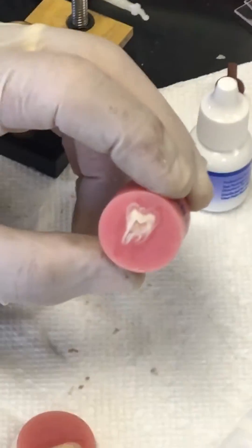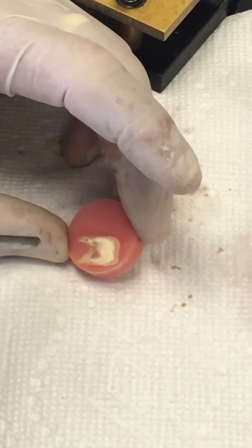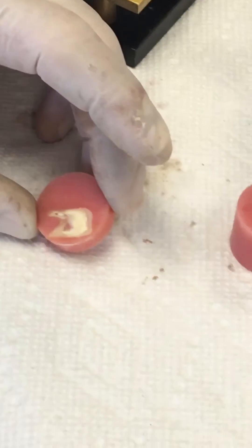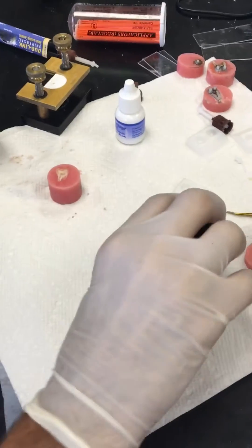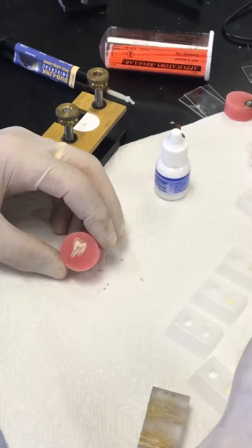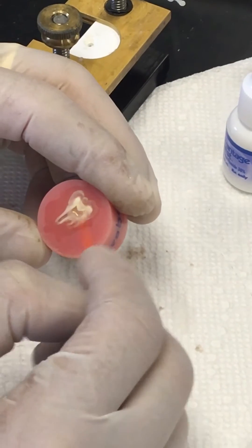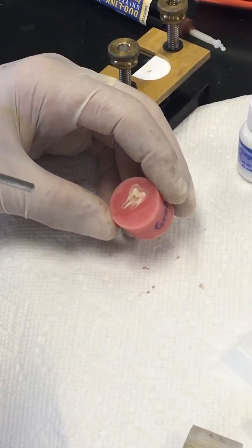As you can see, the tooth is still not black. So I'm going to use All-Bond U on one of the samples. I'm going to dispense All-Bond U and use a micro brush to apply it to the surface. Follow the instructions — just scrub it, evaporate the solvent a little bit.